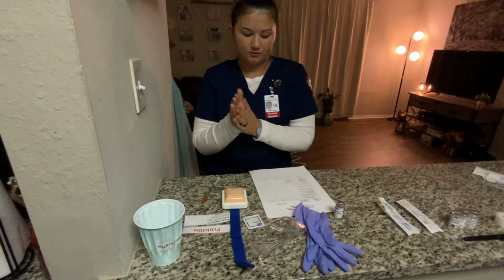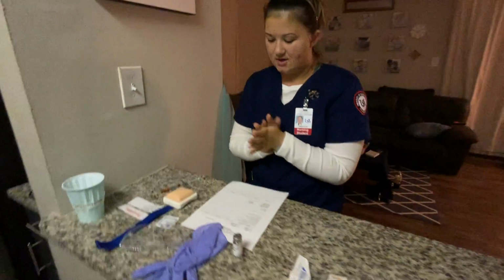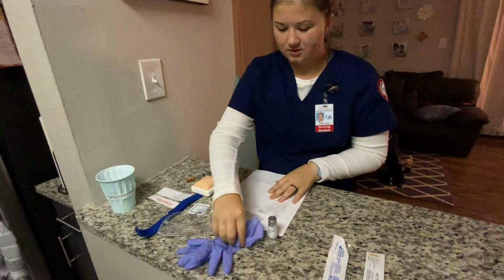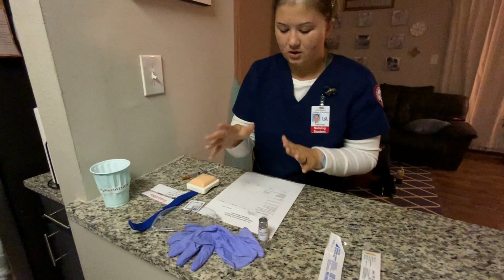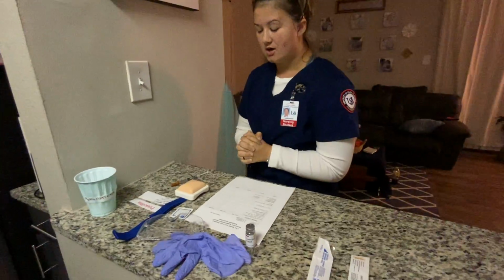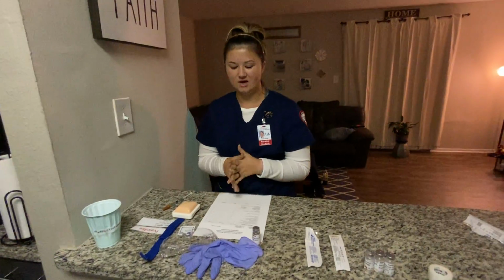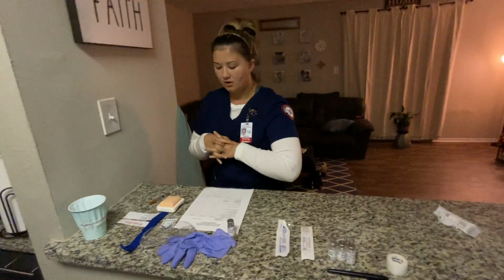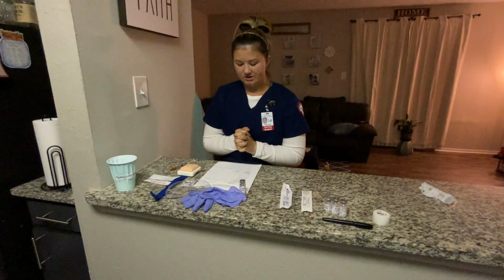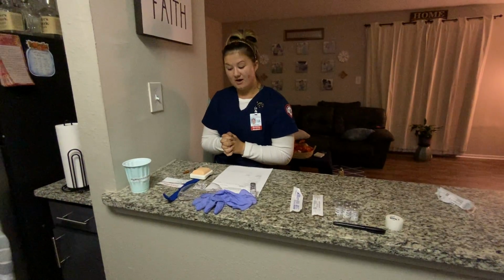So now that I'm in here, I'm going to perform hand hygiene, and I am going to explain the procedure to the patient, making sure there are no questions. I'm going to raise the bed to a comfortable working height. I'm going to lower any side rails needed to be lowered for me to administer this injection. And then I'm going to start my third check of rights.